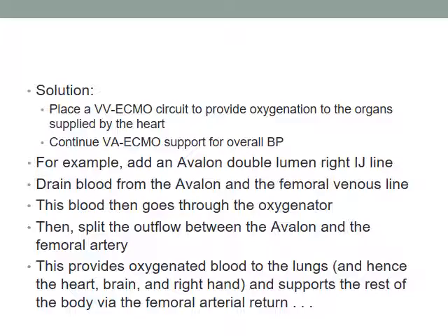What if instead of clamping, you just play with the diameter of the lumen of the catheter? So the question relates to how do you fundamentally make that happen. I say clamp it, you are limiting the lumen.